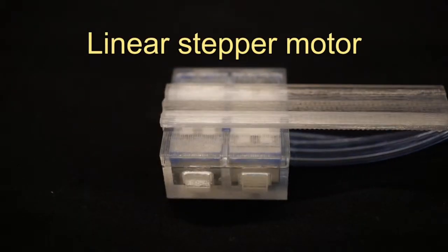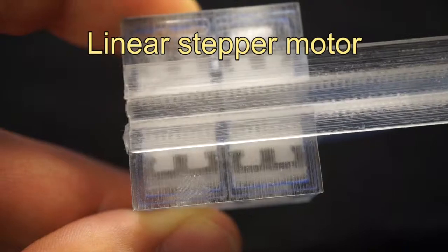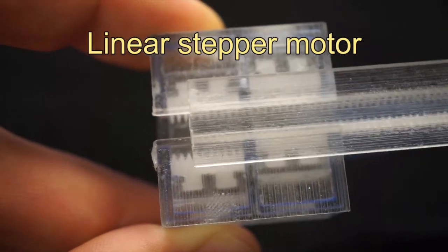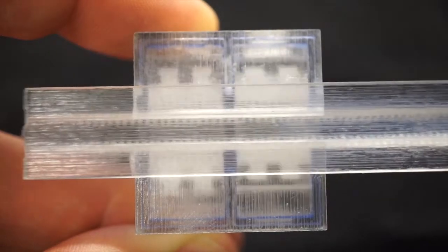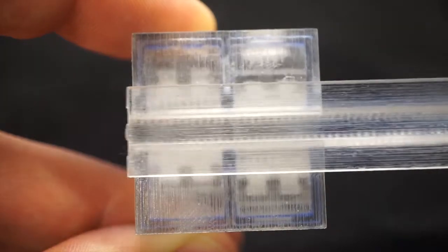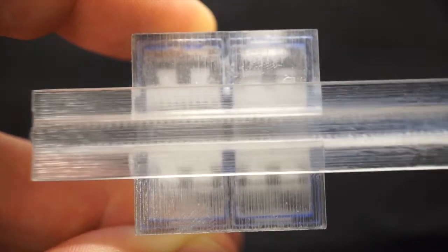This linear stepper motor consists of 2 double acting cylinders. The laser cut teeth of the pistons move the rack sideways in small steps.